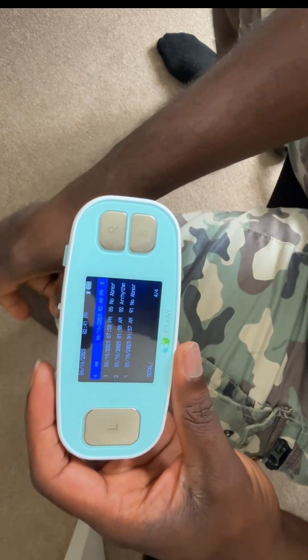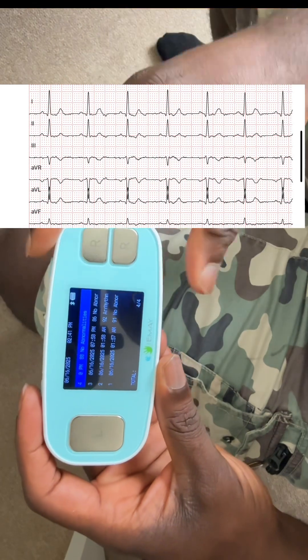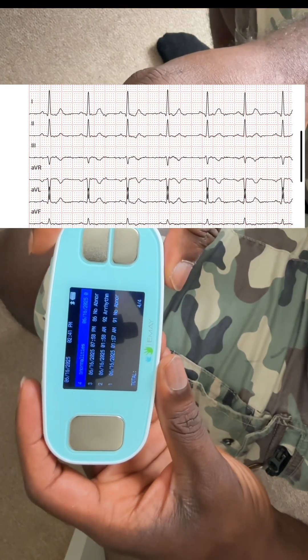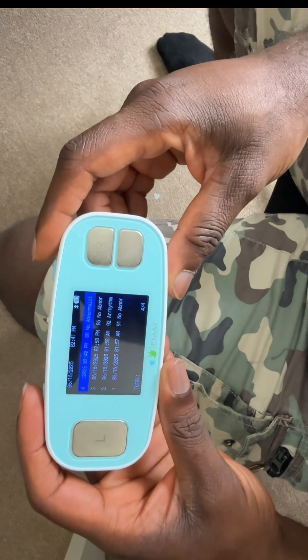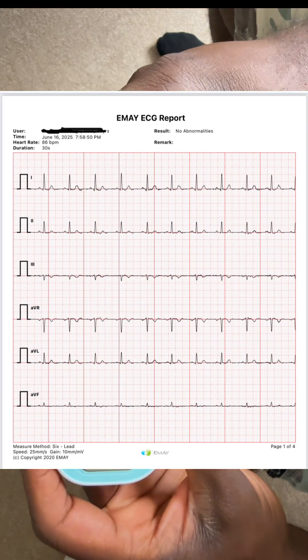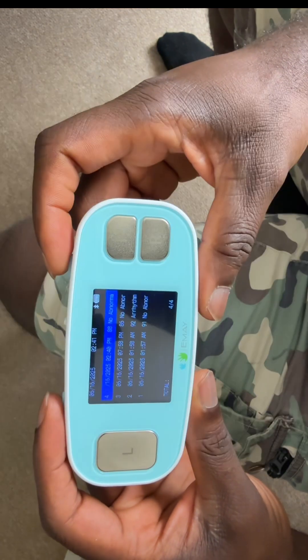This device pairs with my phone. What's going to happen is I'll take a screenshot of what it shows on the phone, since I'm recording on my phone so I can't show you that now. It shows a very clear ECG. You can check it out — it's on Amazon. I got this for my medical company use.